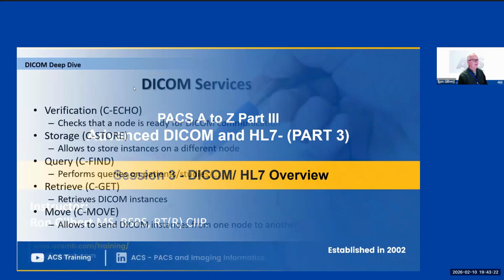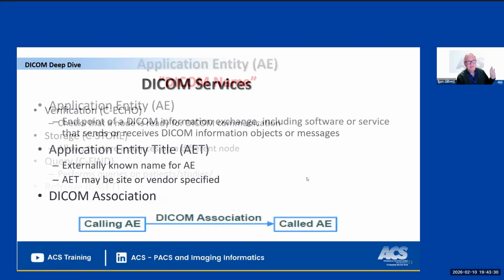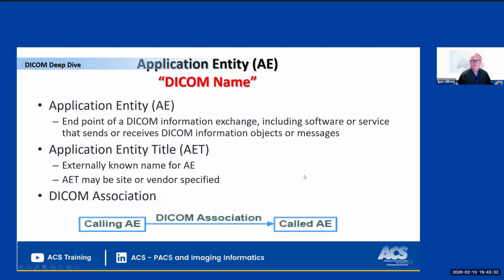So you're going to look at the DICOM services, which is the C-Echo, C-Store, C-Find, all of the different class services that you're doing. I know that's not plain language. I hate to break it to you, but DICOM is an international standard. So we write it in language that can translate easily amongst the world. So the programmers will understand what you're trying to do, because we all know when we go to different countries, sometimes the translation doesn't make any sense. And we don't want that to happen on this system. So that's why we're going to be using new terms you've probably not seen before.